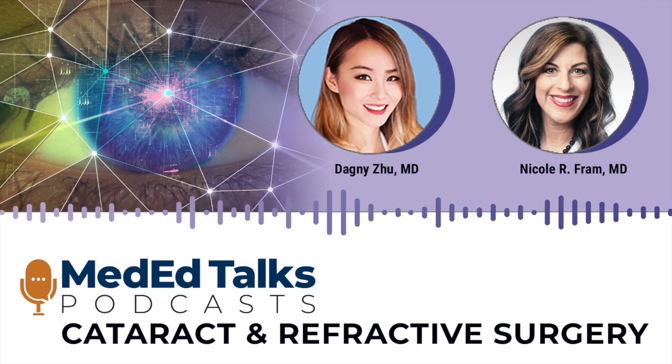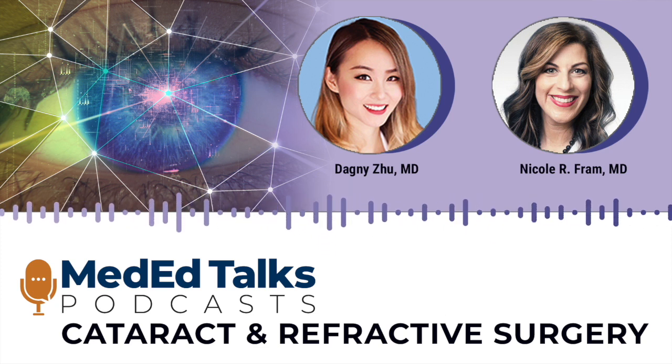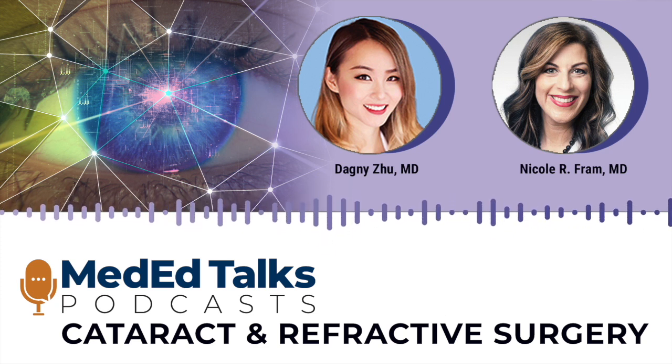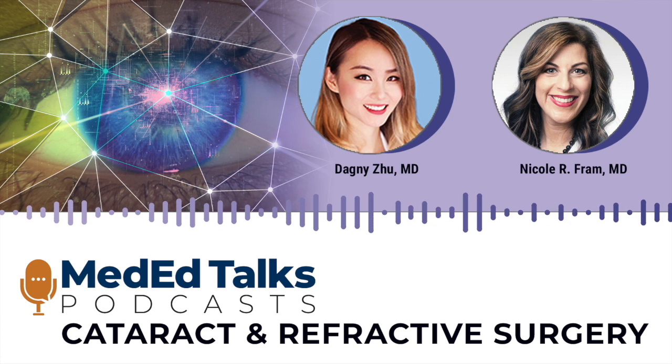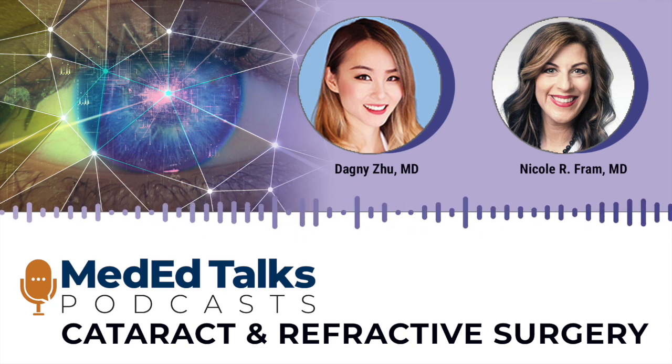Now, this is only taking into consideration steep axis, not magnitude and anterior and posterior corneal contributions. That's where intraoperative aberrometry sometimes wins, is that intraoperative aberrometry is a total aphakic refraction. So it takes into consideration your posterior corneal contribution. But back to having the overlay of the steep axis, it's wonderful.